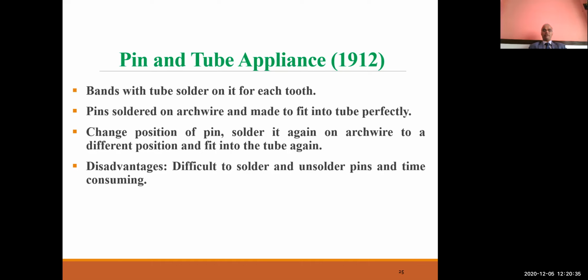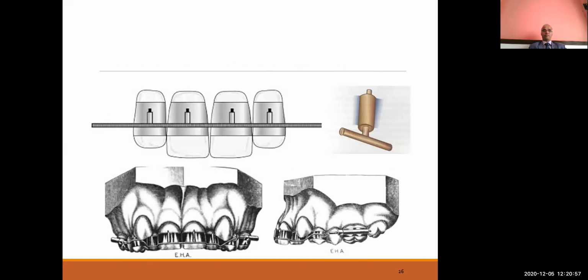So these are the disadvantages because it is difficult to solder and unsolder the pins, and it is time consuming. It is very difficult to precisely place the pins over the arch wire. So it was the major disadvantage of the pin and tube appliance.